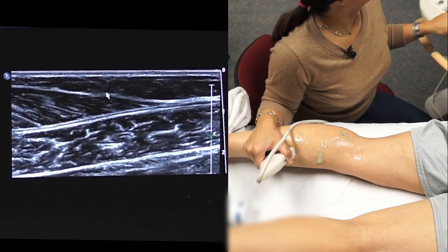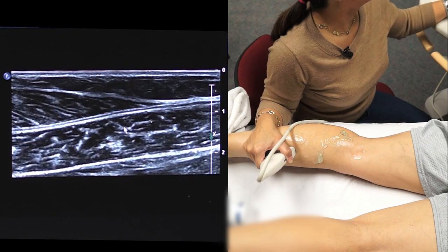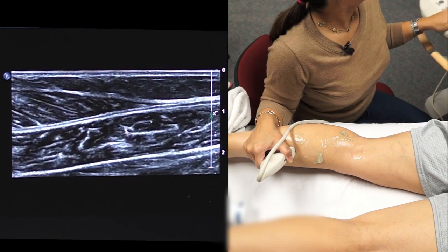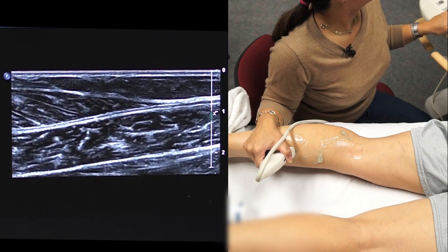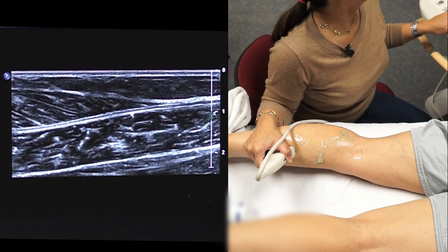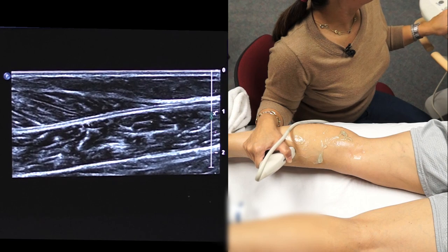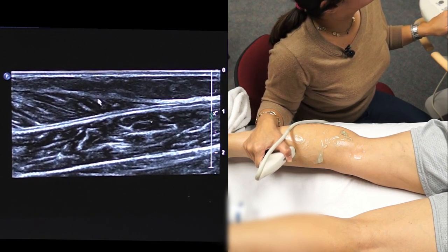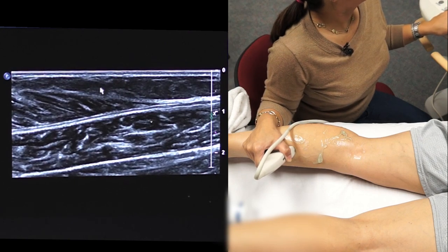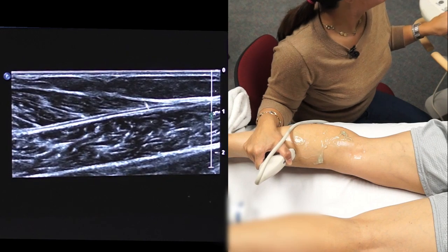But you might see a fluid collection in between the medial head of the gastrocnemius and the soleus muscle. And in that case, you might be looking at a plantaris tendon rupture. And in fact, here is the intact plantaris tendon lying in between the gastrocnemius and the soleus muscles. So if the fluid collection is localized to this location, you might be looking at a plantaris rupture. If you have a problem in the muscle, you might be looking at a medial gastrocnemius tear. And the only other thing to point out is that oftentimes you have both diagnoses, so you might see both.